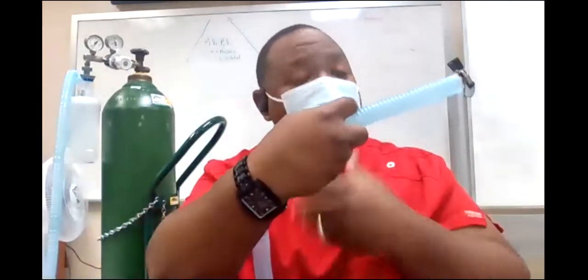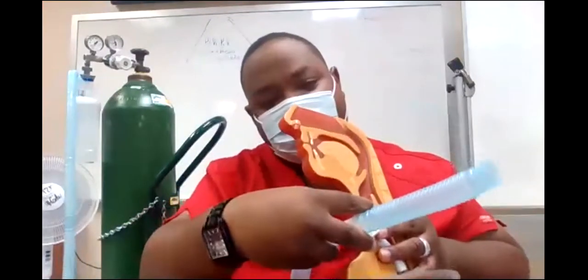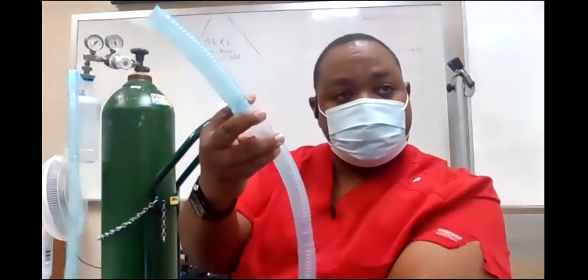So instead of going through all that again, right, I want to test him to see if he can deal without being on the machine. And if he can, we try it with the T-piece. Take the machine off of him and just hook this right to the end of the tube, and see if he can handle that. If he can handle that without a problem, he's ready to be what we call extubated, okay? It's either intubated or extubated. Because I don't want to go through the risk of pulling the tube and he isn't ready. If he's not ready, his sats are going to drop, he's going to be huffing and puffing, his heart rate is going to go up, he can't breathe. He's not healed enough to be off the machine, okay? So we can test them with an ET tube with a T-piece. Or the patient might have a trach, and we can just stick this right over the trach, just like this. And that's a T-piece. This is an aerosol T-piece. So what is he on? Aerosol. What's the percent? 40% aerosol T-piece. There you go. Okay.